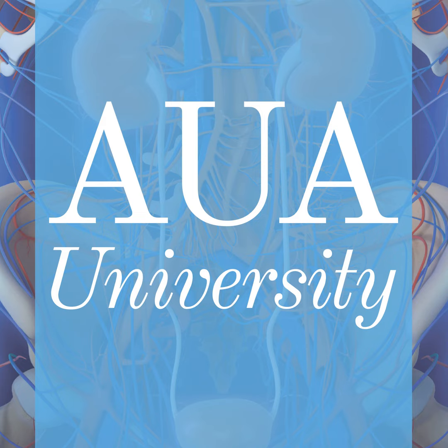Salvage radiation treatment, stereotactic radiation treatment, salvage lymphadenectomy, because like a year ago we received the report telling us there is a lymph node around the iliac vessels. So it could be everywhere, from the common iliac to the internal iliac, the external iliac. With this type of classification system, you have the exact knowledge of where these metastases might be located. And those are some examples.